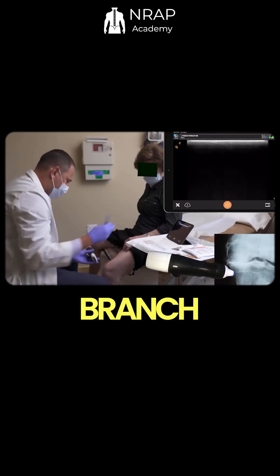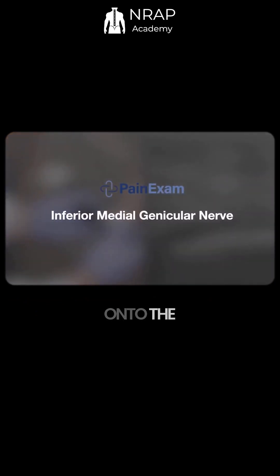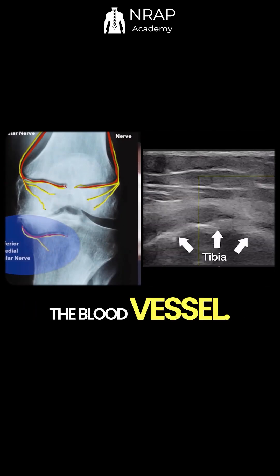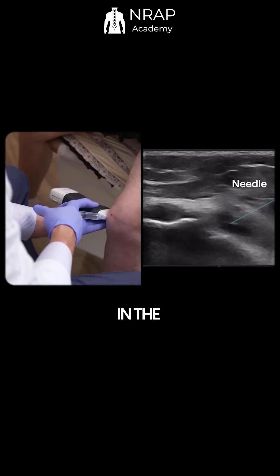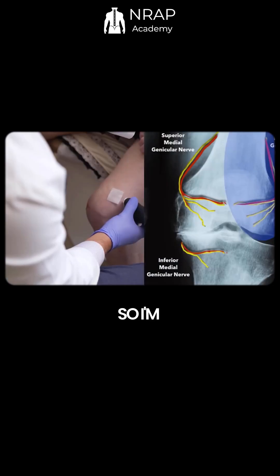Now we're going to target the inferior branch of the medial genicular nerve, going below the knee joint onto the medial aspect of the tibia. Looking for the blood vessel — it appears the nerve is right here — and injecting another one to two milliliters around the genicular nerve in the inferior medial position.